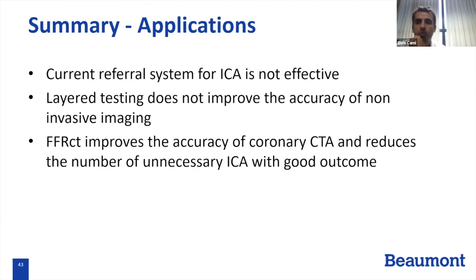The problem with Corlinor is cost, because it costs more than beta blockers. So people are not excited about giving it, but I have used it a couple of times. And we do not make our ordering physicians give beta blockers when they order the study as an outpatient. So if Dr. Basine sees a patient in clinic and needs to get a coronary CT, he just orders a coronary CT.